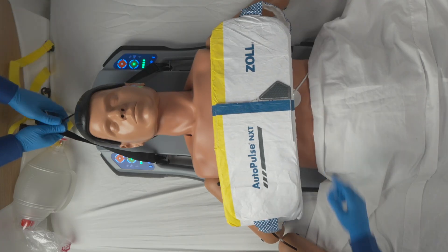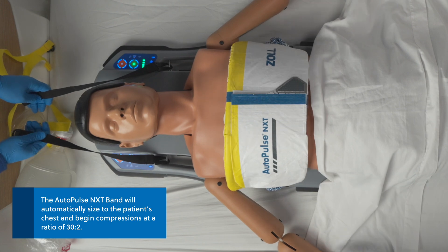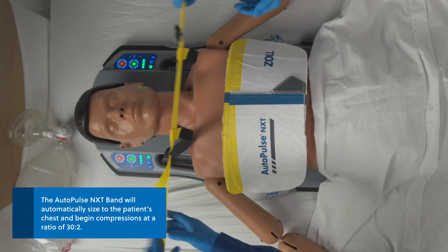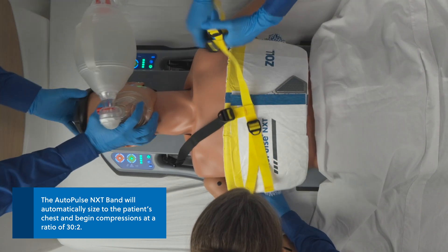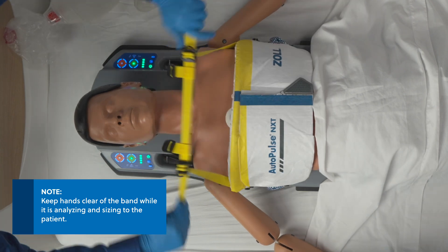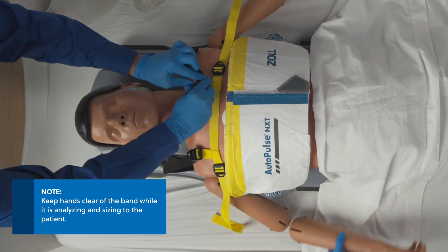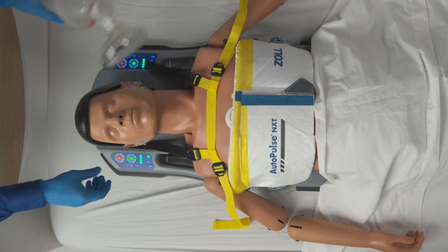Press the green triangle start button to begin compressions. The AutoPulse NXT band will automatically size to the patient's chest and begin compressions at a ratio of 30 to 2. Keep hands clear of the AutoPulse NXT band while it is analyzing and sizing to the patient. Secure the patient to the platform using the shoulder restraints.